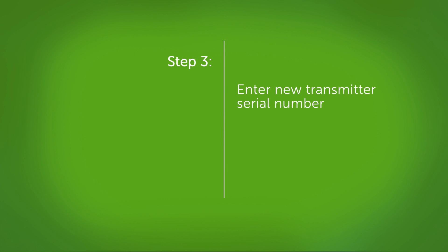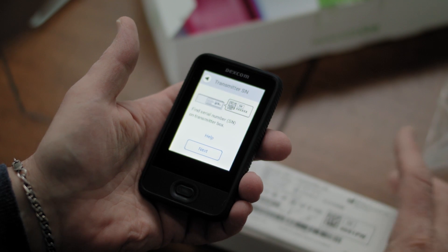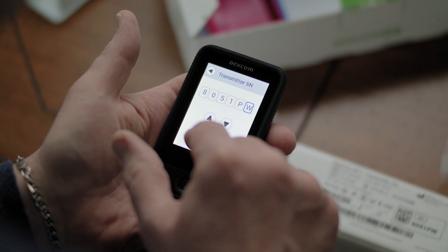Next, you need to enter your transmitter serial number. Find your new serial number on the back of the transmitter box. Enter your new serial number.